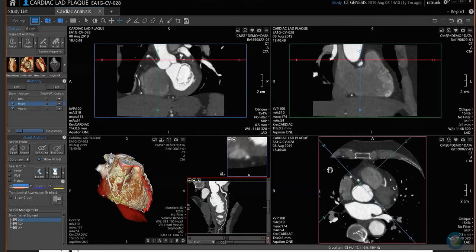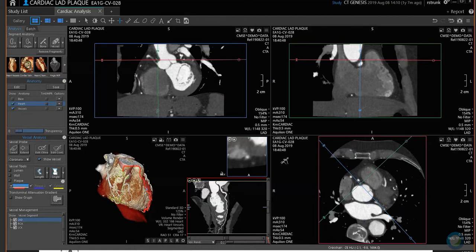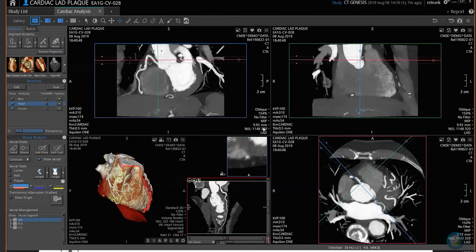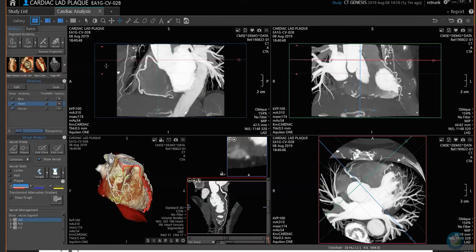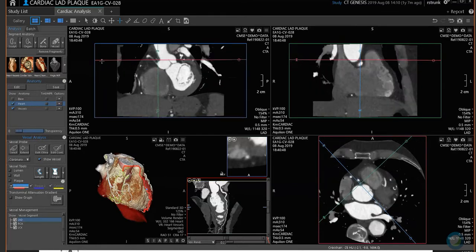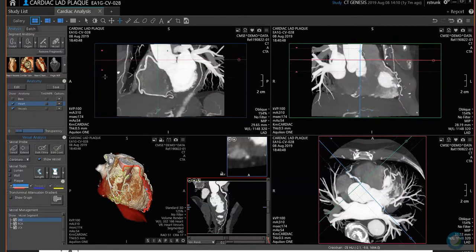You can also follow a vessel by moving your mouse off of the line. If you want to change your thickness — the default here was scanned and reconstructed at 0.5 — on any of the crosshairs that have little triangles, you just take your left mouse and pull it apart. You can see in the bottom right it will tell you the thickness. It's something you do on the fly to get a good lay of the land. You drag it with your left mouse.